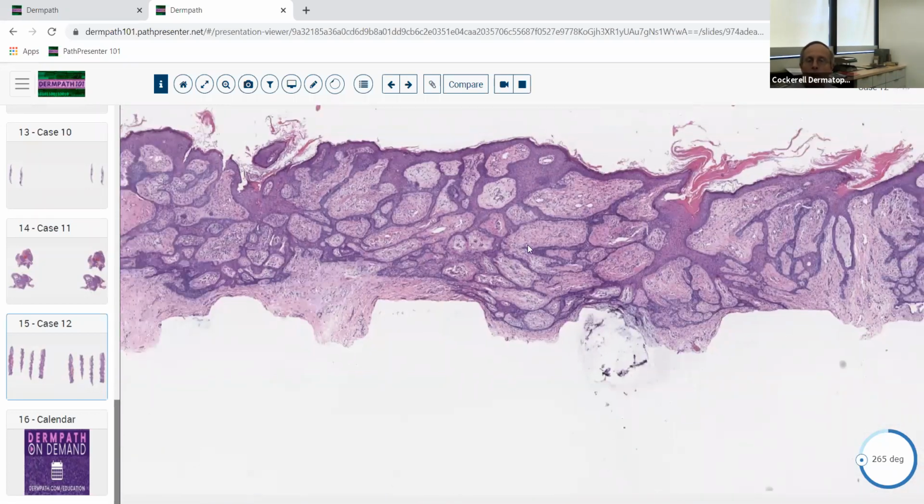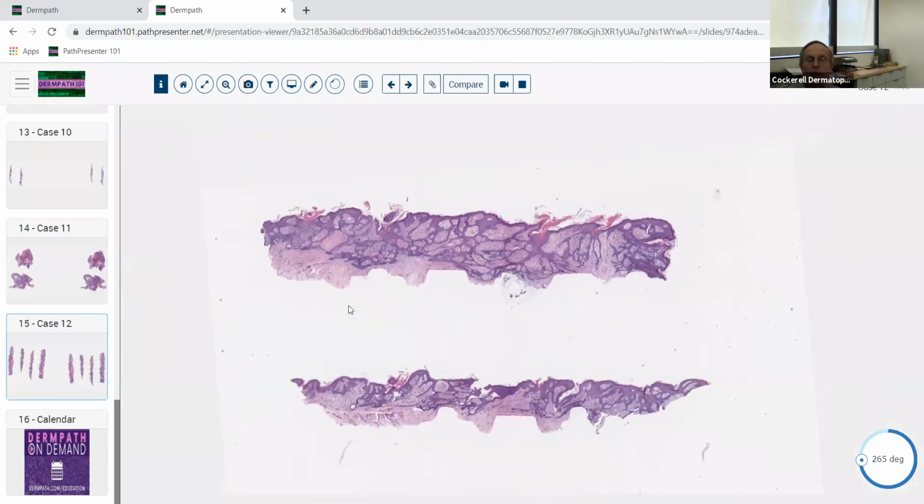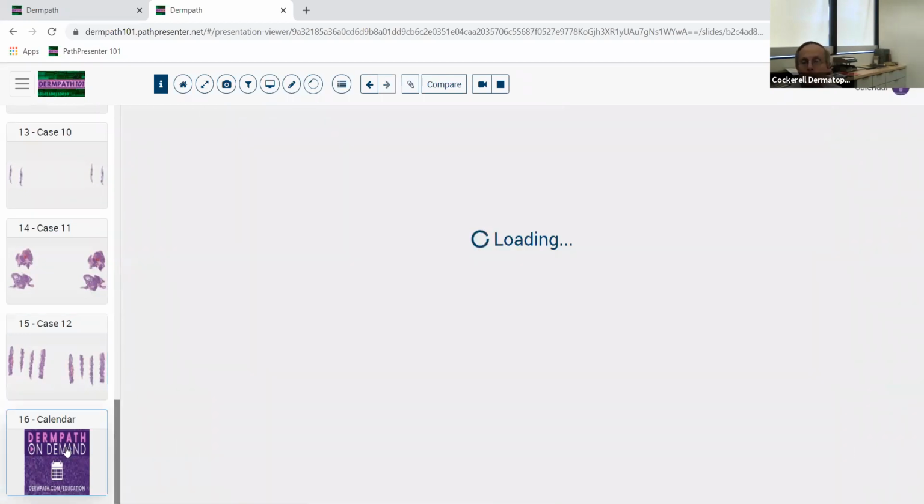So that's fibroepithelial tumor of Pinkus. There are a lot of other variants of basal cell carcinoma. Morpheoform basal cell carcinoma, we showed you the sclerotic lesion before, looks more like that with a diffuse pattern. You can see some with really small islands of basaloid cells over a broad front and thick sclerotic stroma that can simulate desmoplastic trichoepithelioma and also microcystic adnexal carcinoma. You'll learn more about those when we deal with some unknowns and other things like that. But this is a nice overview, hopefully, to supplement your lecture on some different variants of basal cell carcinoma.